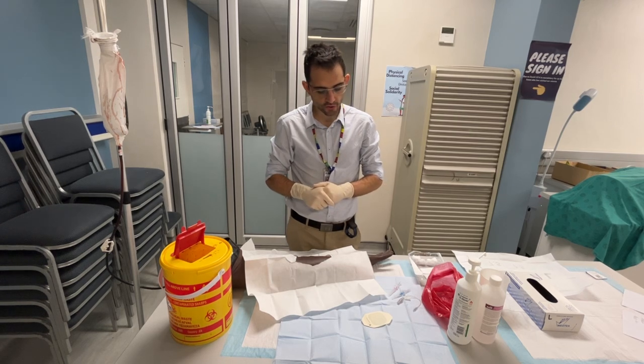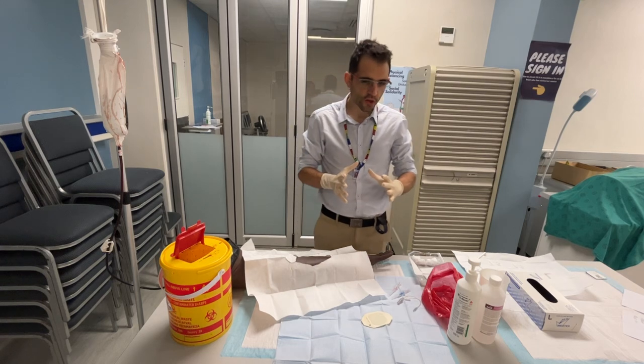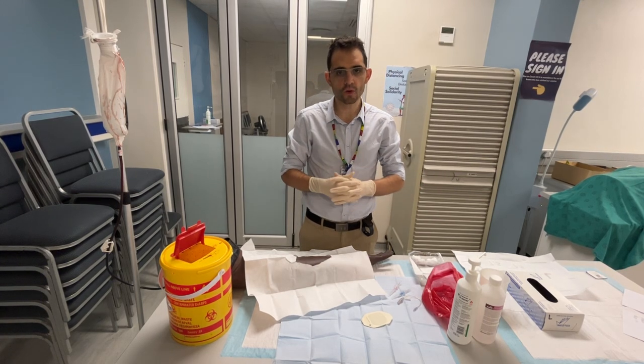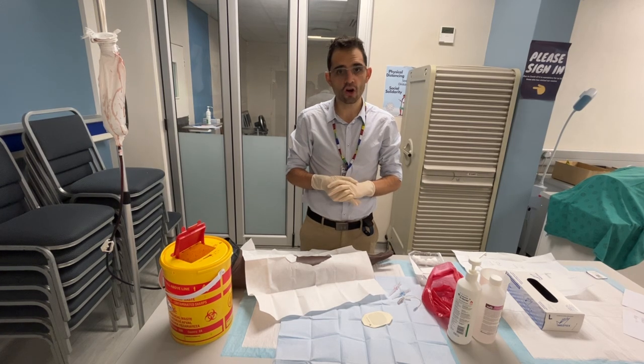Today I'm going to show you how to put up a drip and prevent a needle stick injury. I'm not going to show you the actual process of putting up a drip in a sterile manner — you can go to the GSH Infectious Diseases YouTube video to watch how to insert a drip in a sterile manner.